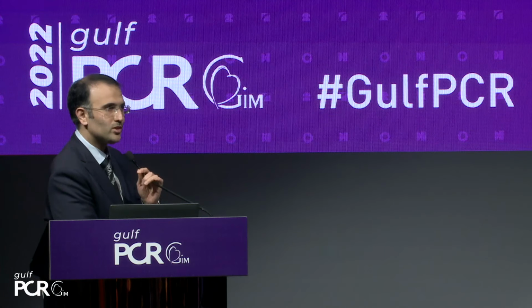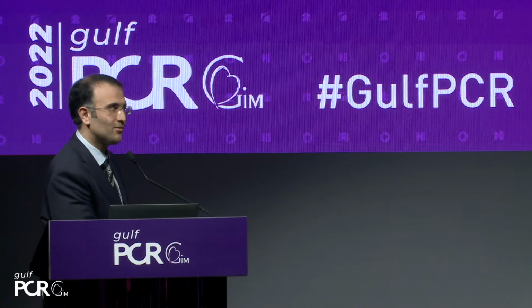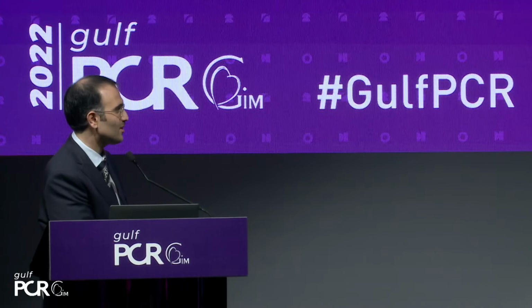Good. What do you think about, and this is just an opening question, the rota when you have a nodular calcification? Because some people say that even the rota wouldn't work in nodular calcification. Anybody? But the right question was addressed about the size of the burr. Yes. The vast majority start with a 1.5 without being based on sizing.